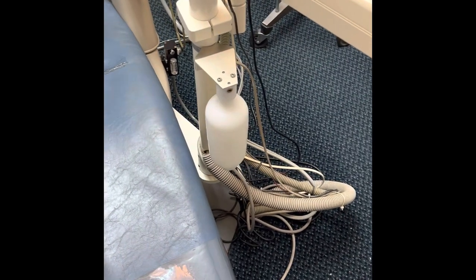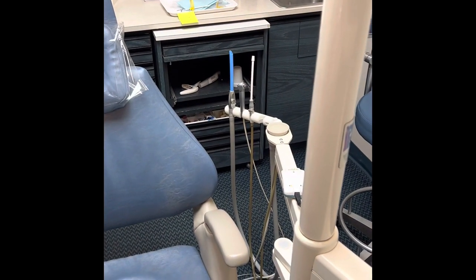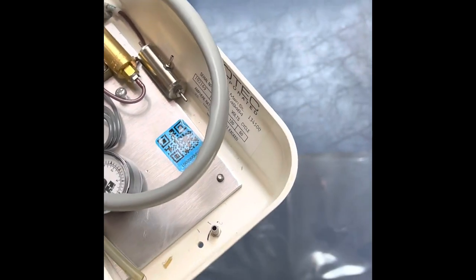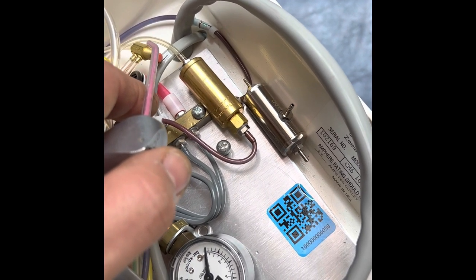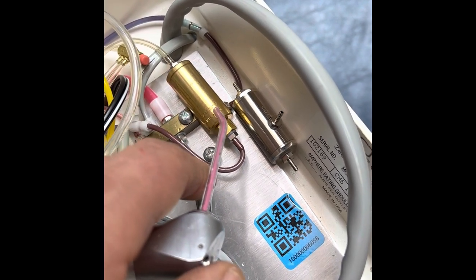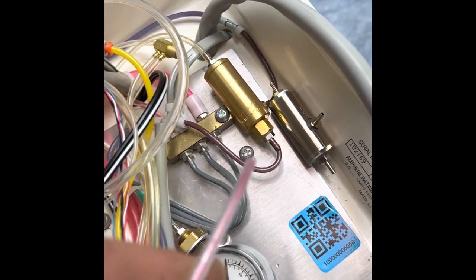I actually just got done changing two manifolds on this at this office. The other air water syringe right there does not have the symptom. And when I was troubleshooting, I came to the conclusion that this clipper valve is actually bad. I think for some reason there's air coming through here. I don't know how, but something's going on with this and I don't know why.